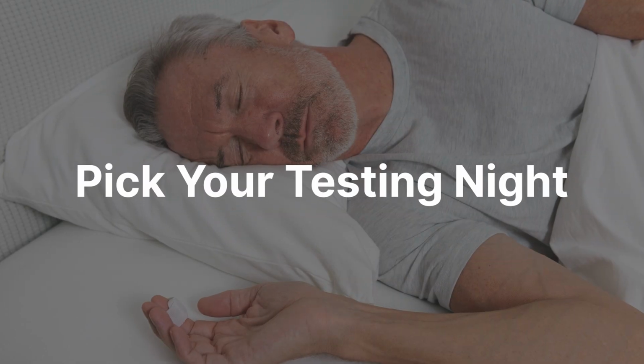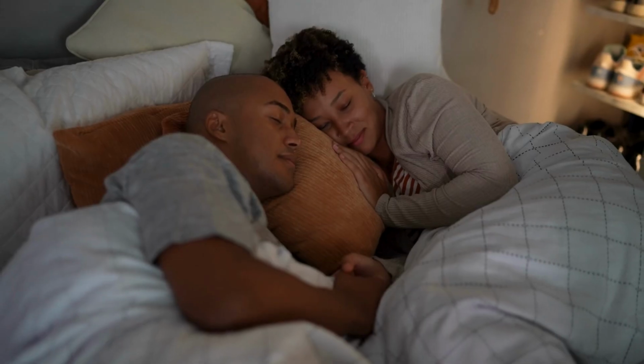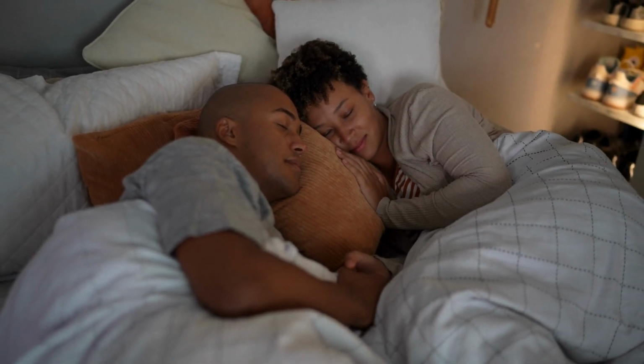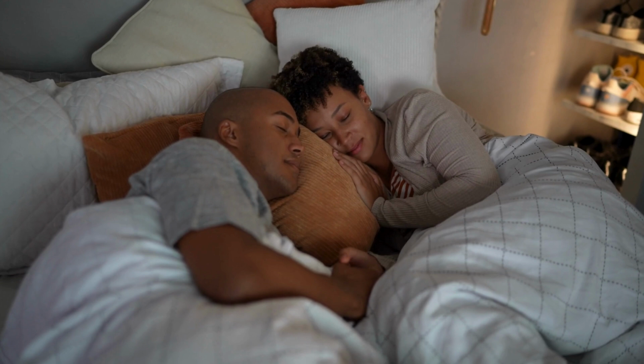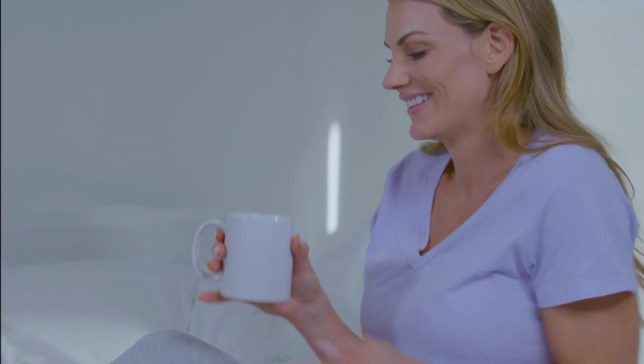Step 2. Pick your testing night. The best night to start testing is tonight. Don't stress over finding the perfect night's sleep. Simply choose a night that feels typical for you. Just follow your normal evening routine. If you usually take supplements, that's okay, but try to avoid caffeine or chocolate about 4 to 6 hours before bedtime. If you use a CPAP, please skip it for that test though.